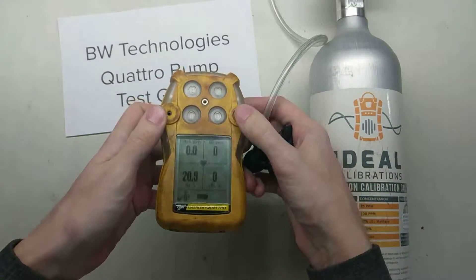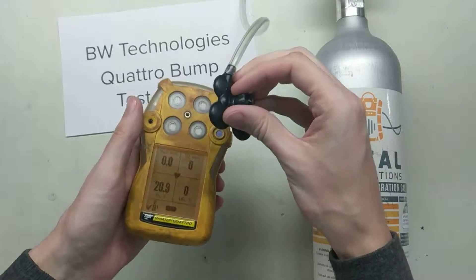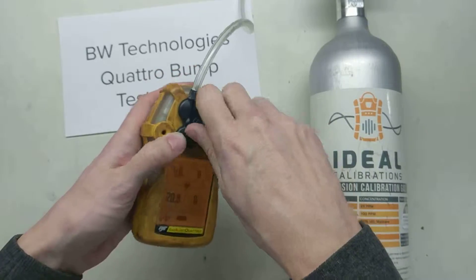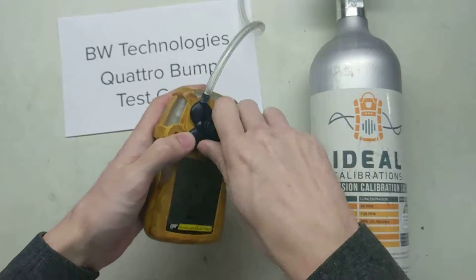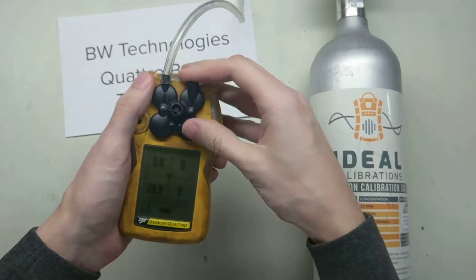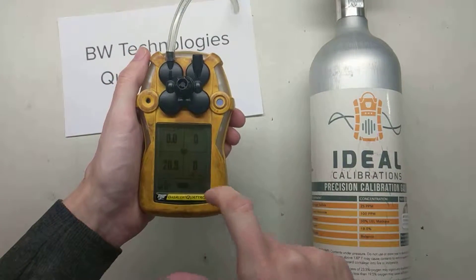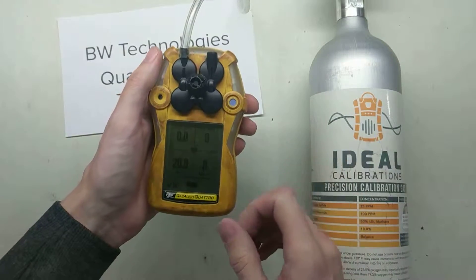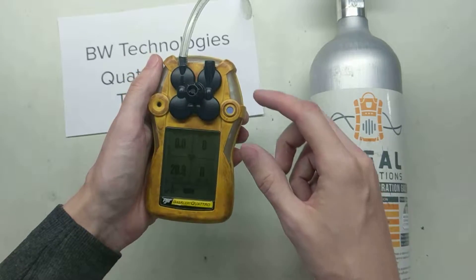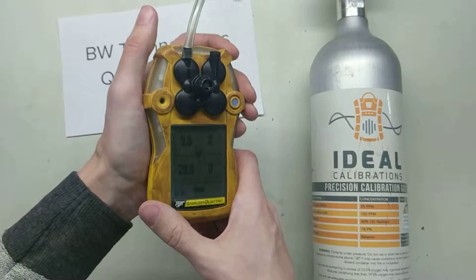Now we've got our Quattro. We don't need to hit any buttons or anything along those lines. This type of bump test is just a functional bump test — we're making sure that everything works on it. Go ahead and screw the calibration adapter into your monitor. What we're making sure is that all of our sensors are going to be going upwards in value, that the horn is audible, that the lights are flashing, and that the monitor is vibrating properly.